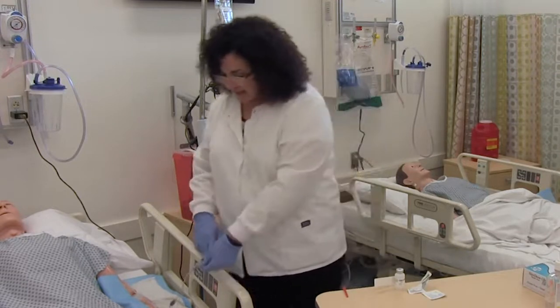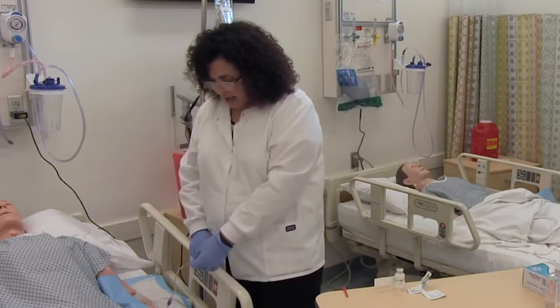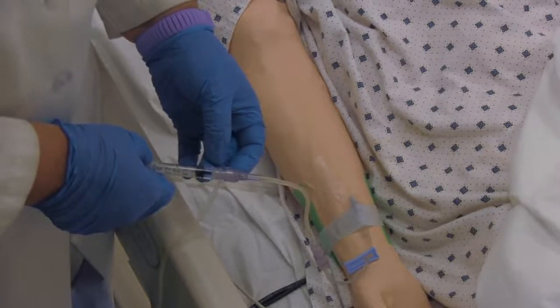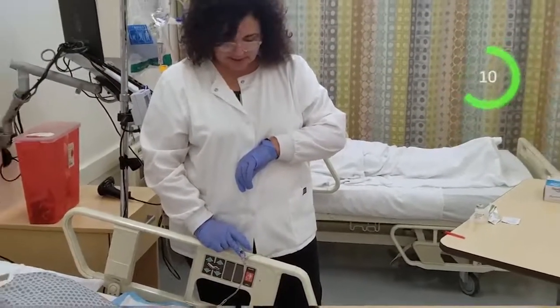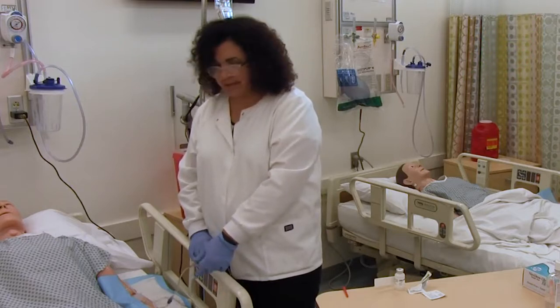So 15 seconds has passed. So again, I pinch, I push the next increment, the next 1/4 mil, and then I release the tubing, and then I will pause for 15 seconds before pushing the next increment. Pinch, push, release.